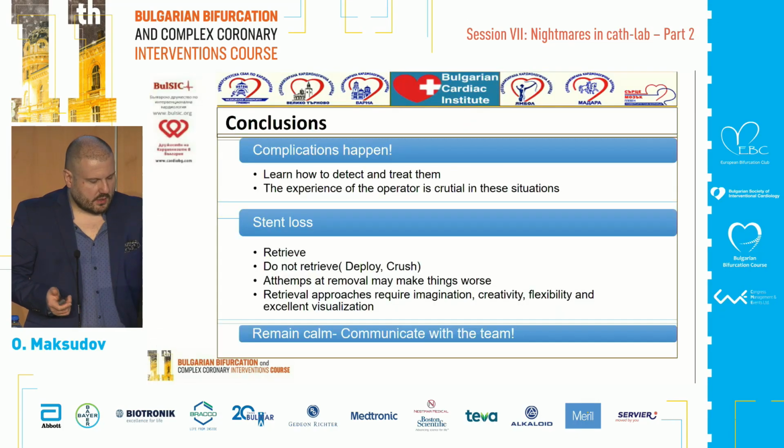So the patient was discharged completely symptom-free. The conclusion from this case, for me especially because this is my case, is that the complication happened. We must learn how to detect and treat them, and the experience of the operator is crucial in these situations.